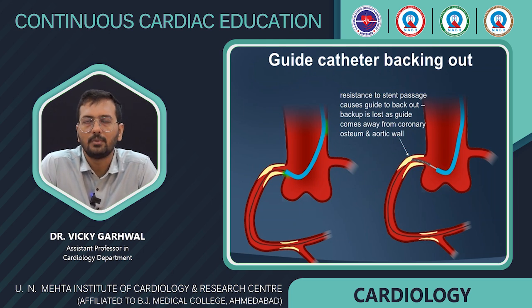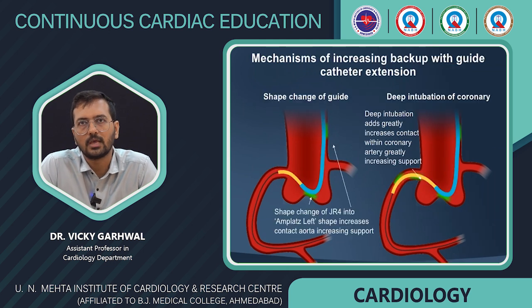So we need the mother and child technique for this, and for deep engagement, we have to use guide catheter extension. So they provide shape change of the guide, the shape change of the JR4 into Amplatz left shape.